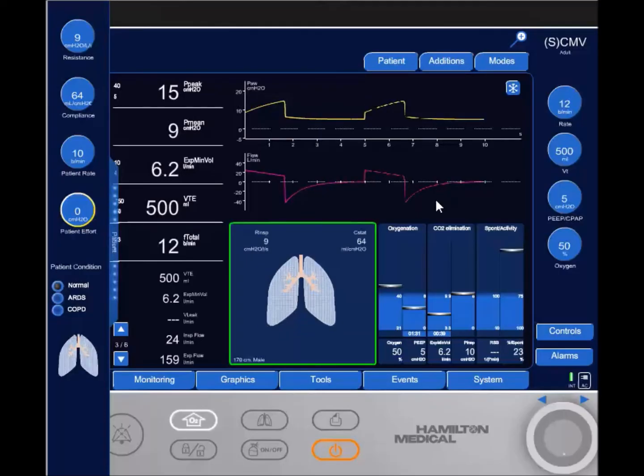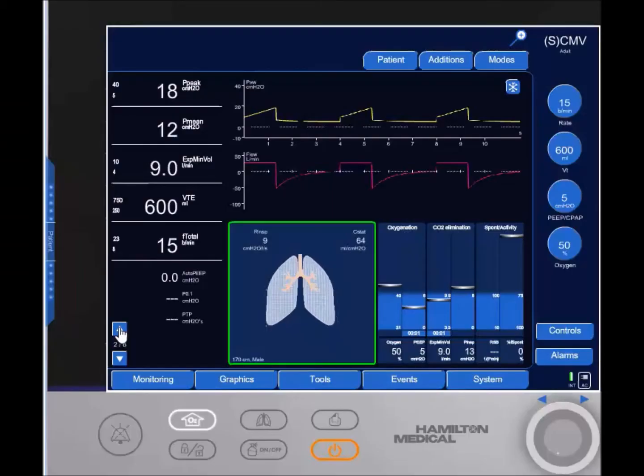Number two, does it maintain a specific breathing pattern? We need a signal input, such as an end-tidal CO2 device, to maintain a specific breathing pattern. So volume control CMV with set point does not have this capability either. Can your mode automatically limit auto PEEP? Can volume control CMV with set point targeting limit auto PEEP?